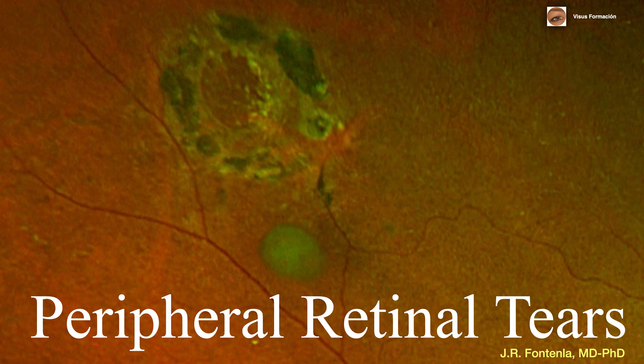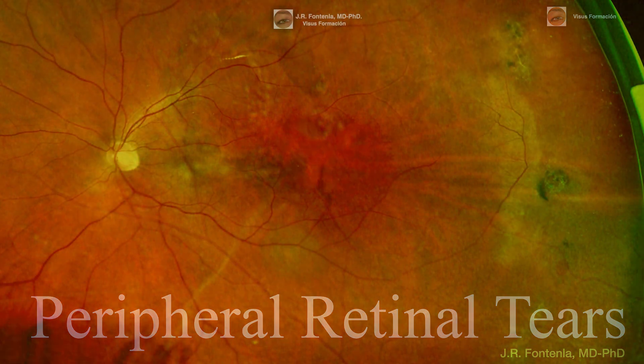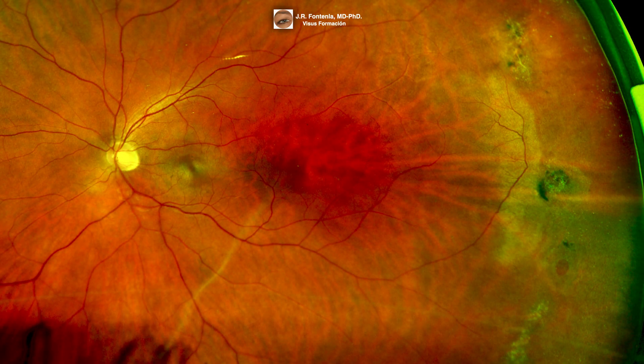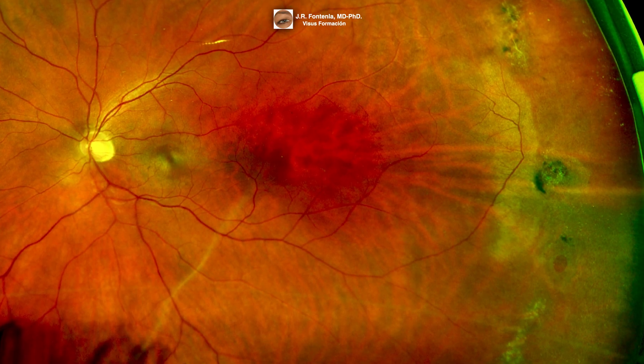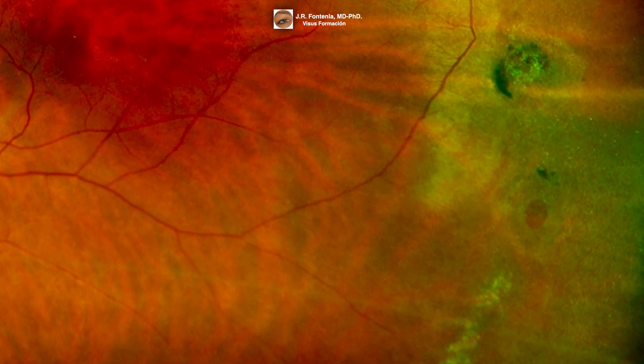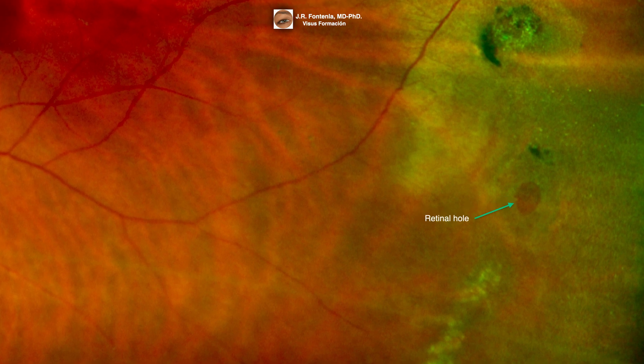In this video, we are going to talk about peripheral retinal tears. Pointed by the arrow, we can see a peripheral retinal hole.